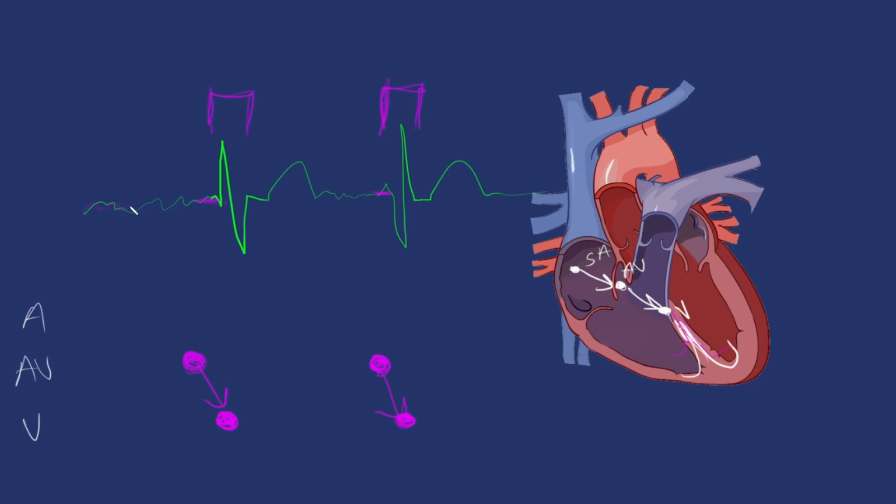Now what's going on here? We have these random wavy lines. So there's some kind of atrial depolarization going on, and it's just random signals basically coming from all directions. There's no discernible P wave. And the reason there's no discernible P wave is because this is coming from everywhere. So if we draw this over here, if we're going back, the ventricles have depolarized like normal. And we know that came from the AV node.